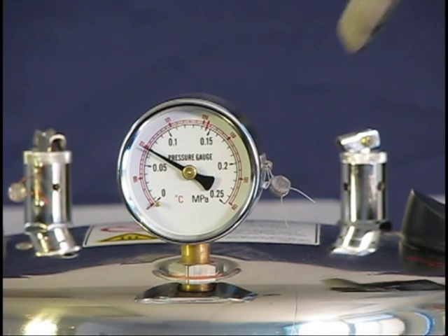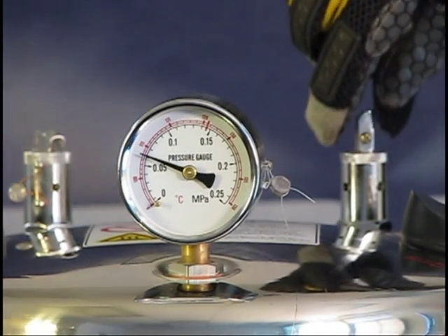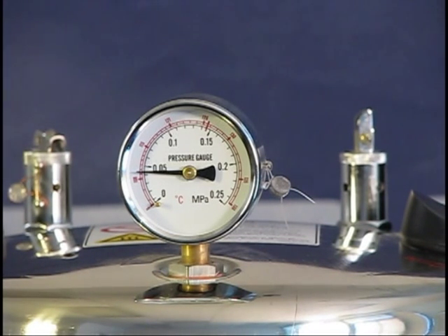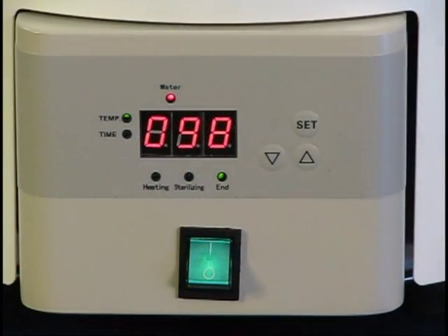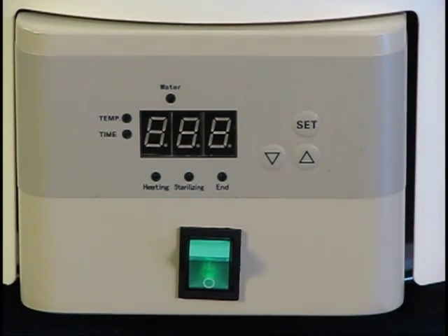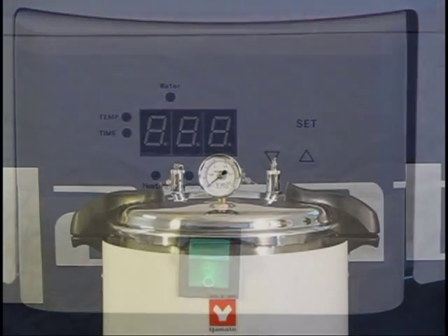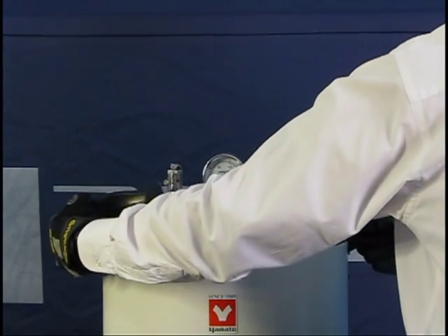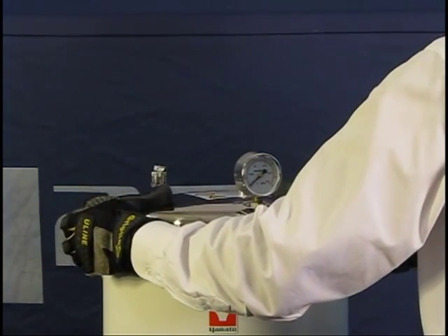To quickly release the pressure and accelerate the cool down process, carefully release the exhaust valve while wearing heat resistant gloves. Turn the unit off and let it cool down to approximately 40 degrees Celsius before removing the lid. To properly remove the lid, twist counterclockwise and lift the far side up.